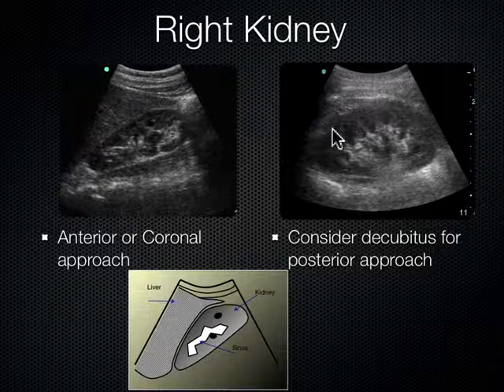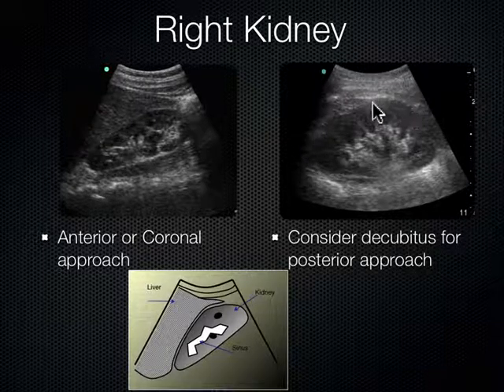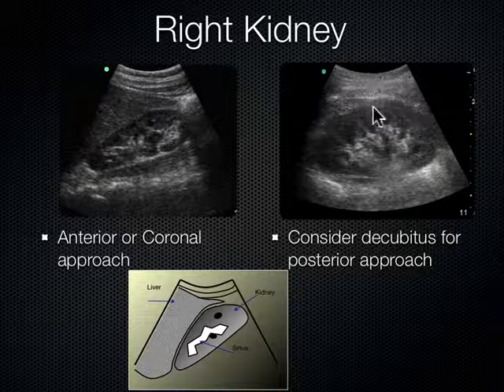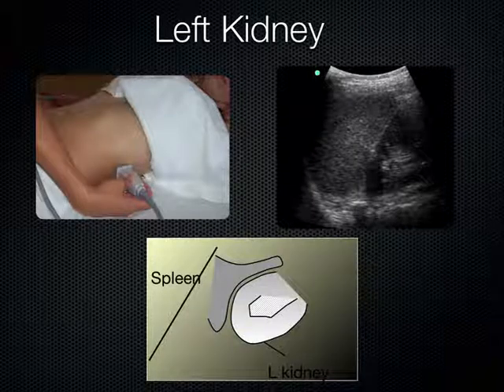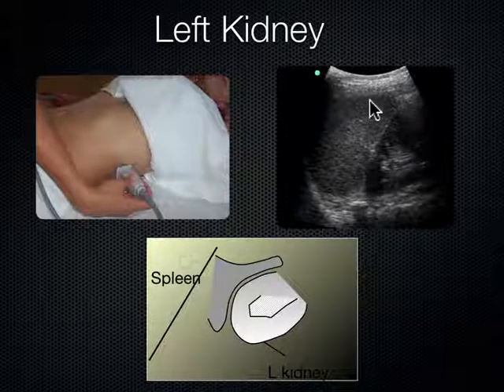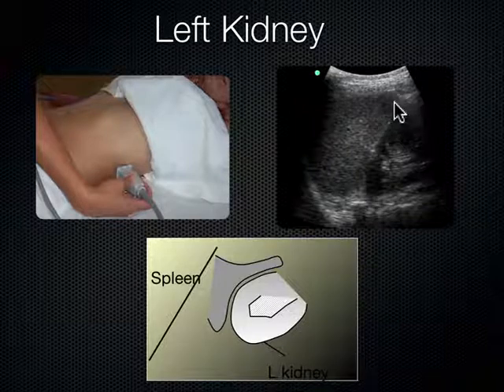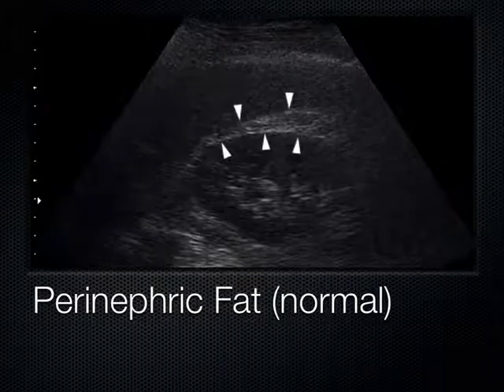When we roll the patient into left lateral decubitus and put the probe on the back between the ribs, we can see the kidney in long axis with no liver in the window. We can actually see how close the kidney lies to the skin line — about two centimeters deep on this patient with a posterior approach. The left kidney is more towards the head and more towards the bed — more superior and more posterior. The tip of the spleen is smaller than the liver, so we may lose part of the kidney using a coronal approach on the left side.